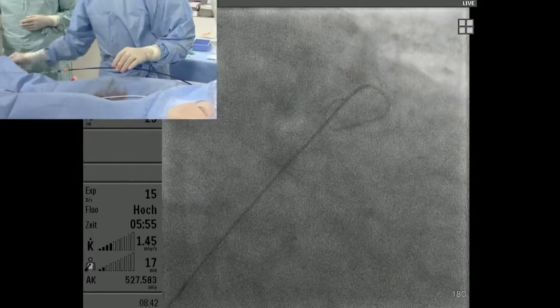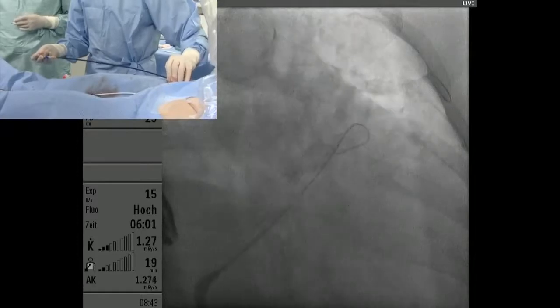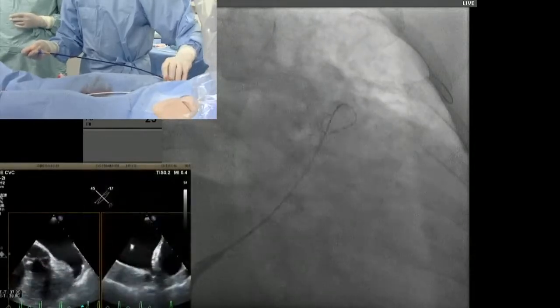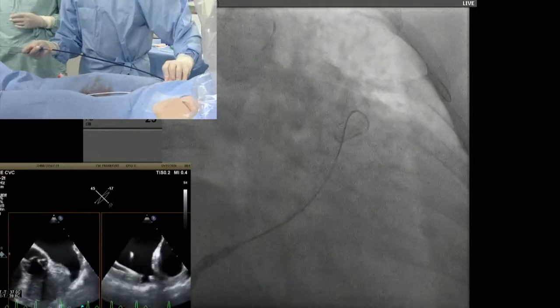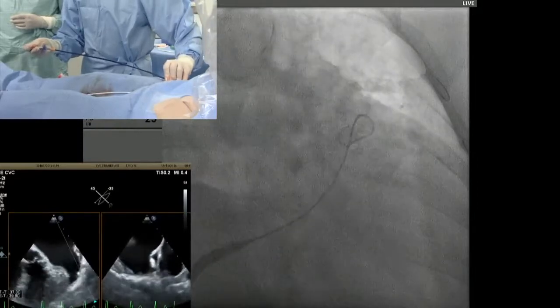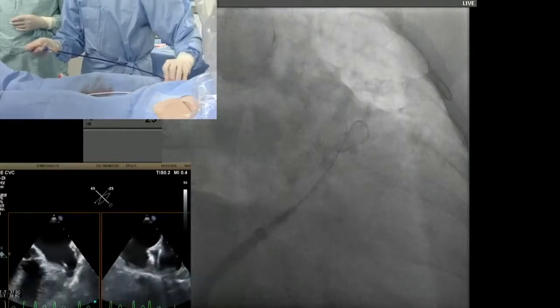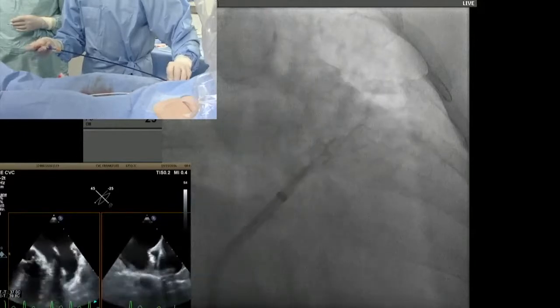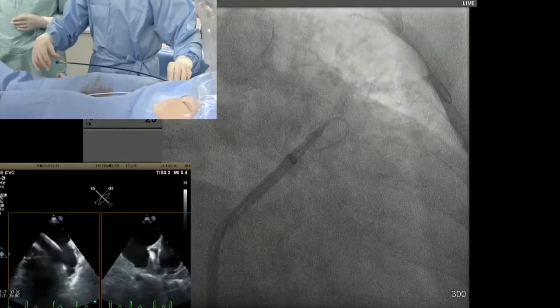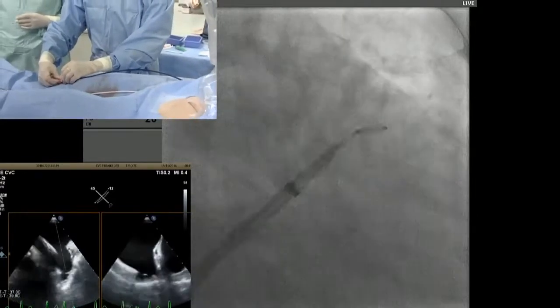Let's zoom out here so we can better see. Now again, this is a situation where you have to pay attention. So it's close to the septum, and I have to orient the curve of the sheath so that it directs towards the appendage. I'm slowly rotating. The thing about the 45-45 is just occasionally you can flick the wire out at this stage coming across the septum. So I'm carefully advancing now. Yeah, zoom in, please. Now at this point, I keep the dilator in place and advance the sheath only.